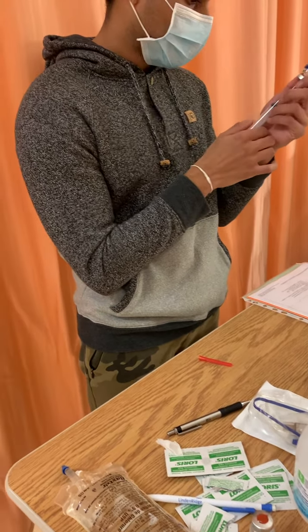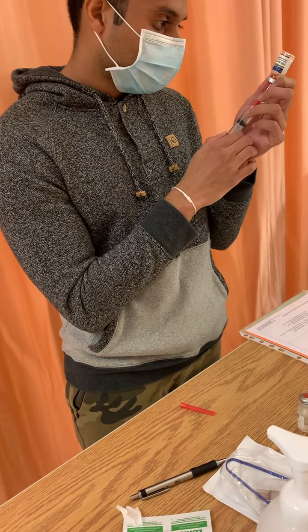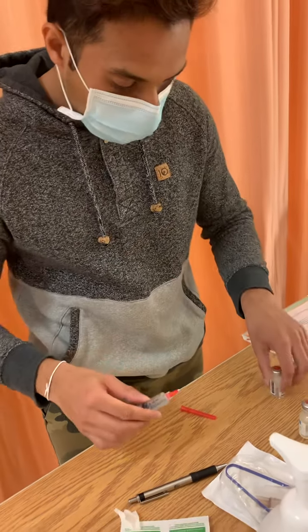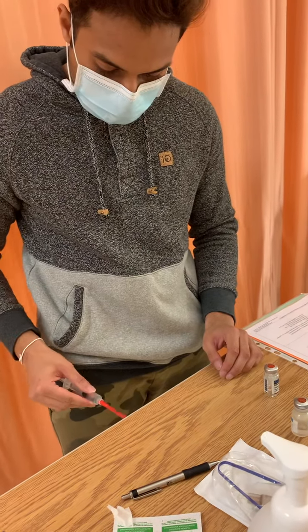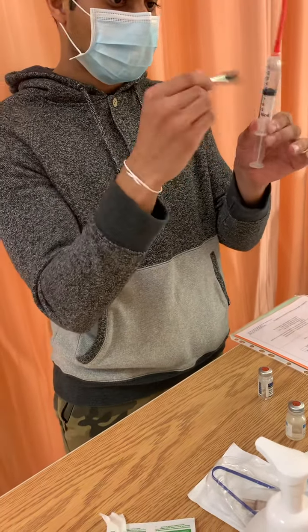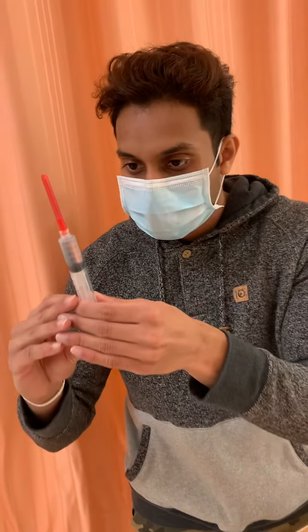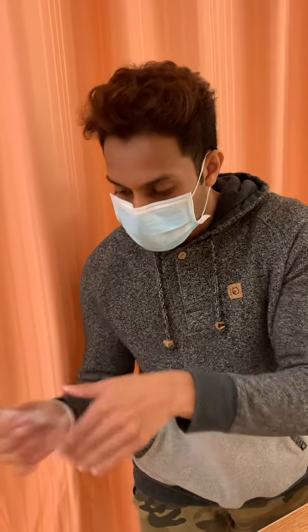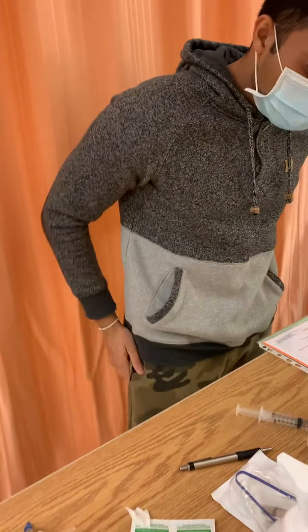So we're now drawing back to get 4 ml of the medication. So we're just drawing a bit of excess so we can get rid of the air bubble. So we're just going to draw back, and knock out the air bubbles, and we're just doing this over the med waste, until we get the calculated amount of 4 mLs. This is over the med waste. So there's 4 mLs in there, that's the correct ordered dose. And we're just going to do our second check.